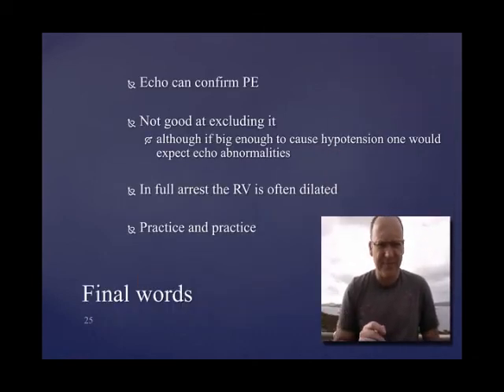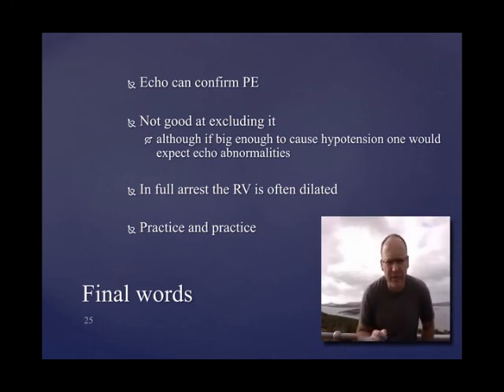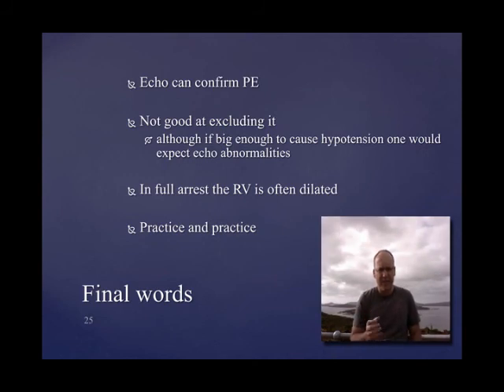So finally, echo can be very useful with confirming a pulmonary embolism, but most importantly, it's not good at excluding a pulmonary embolism. If it's big enough to cause hypotension and peri-arrest, you'd expect to see echo abnormalities, but you really have to fit it into your clinical picture.